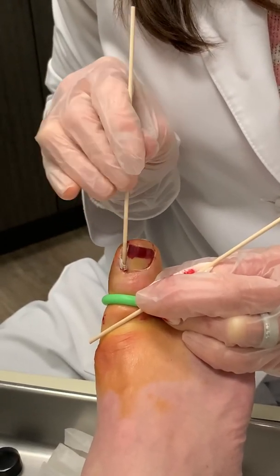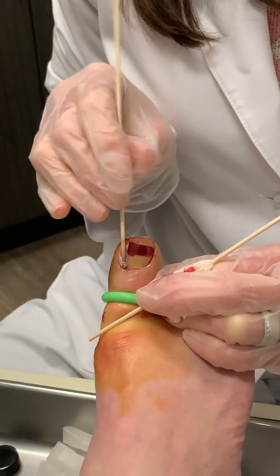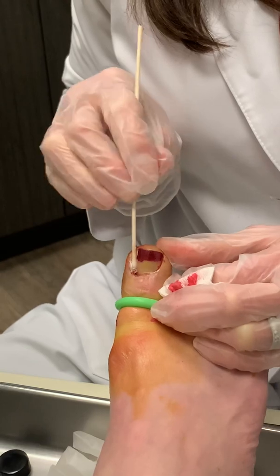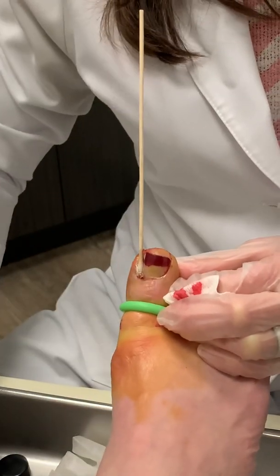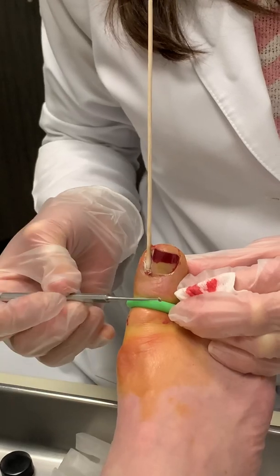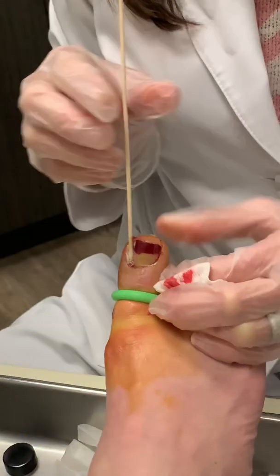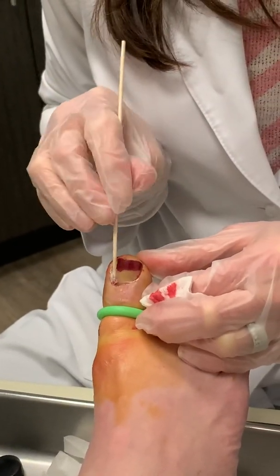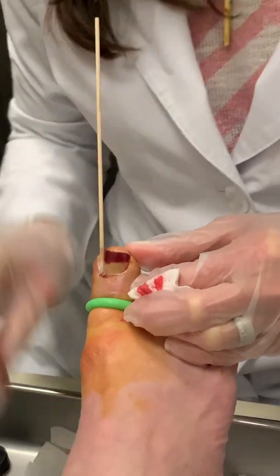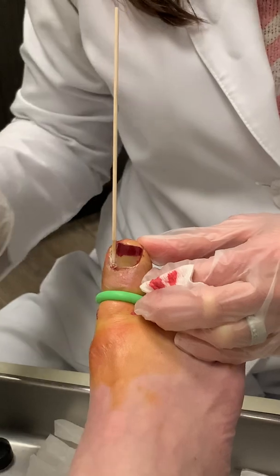After the procedure, since it is a chemical that creates a burn, it's very normal that she may have some redness at the base of the nail around this whole periphery underneath here. If the redness extends past where this little tourniquet is, that's more indicative of an infection, and you should always call the office if you experience that, as we may need to get you on an antibiotic.